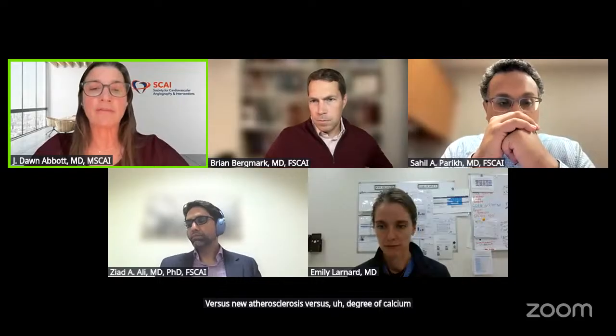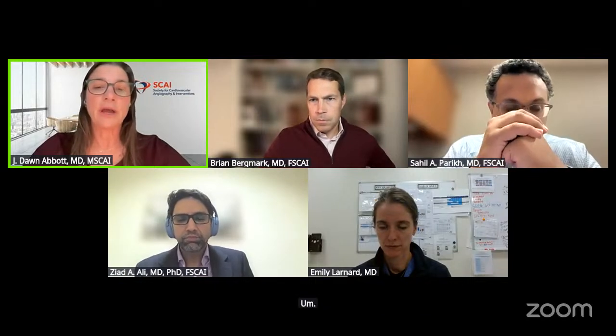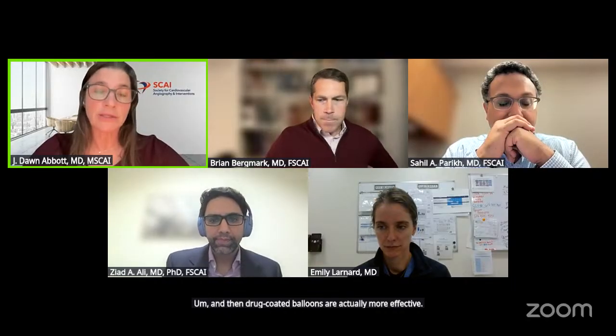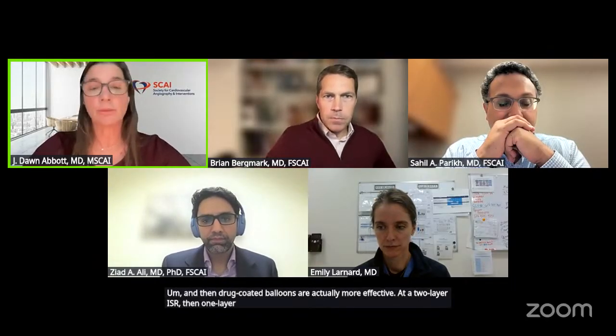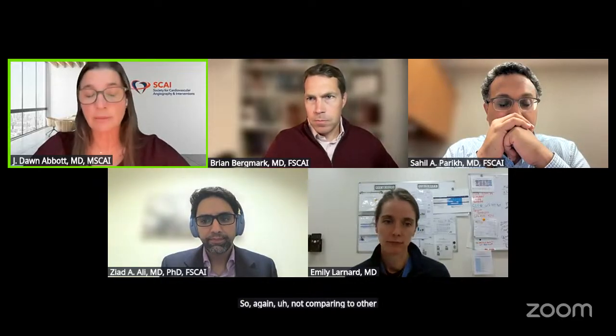So we don't have a clear-cut study showing that, even though inherently I think that may be true. And then drug-coated balloons are actually more effective in 2-layer ISR than 1-layer ISR compared to POBA. So again, not compared to other modalities, but compared to POBA.